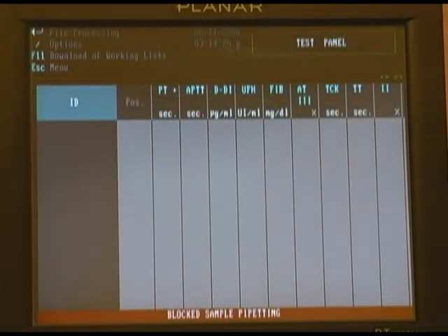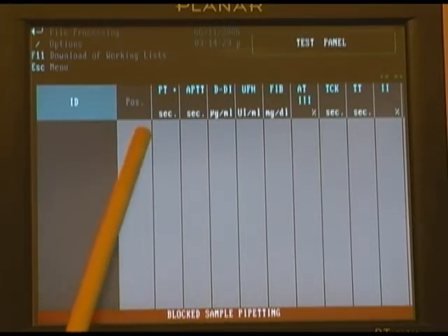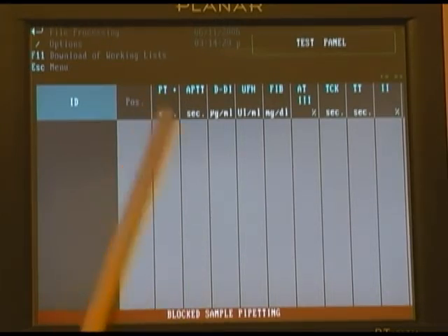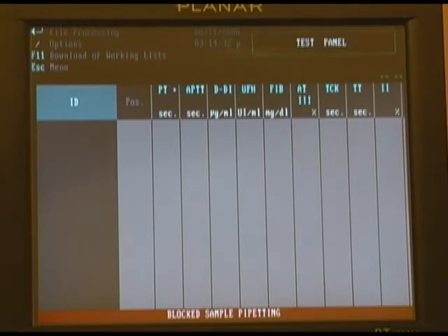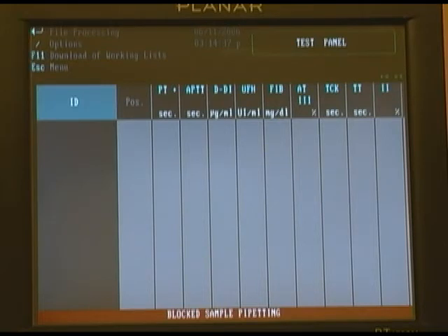You can now see, after the system rebooted, that our test panel now displays the prothrombin time as the first test. This can be set up as user-definable, based on how you would like your tests to appear on the test panel screen.